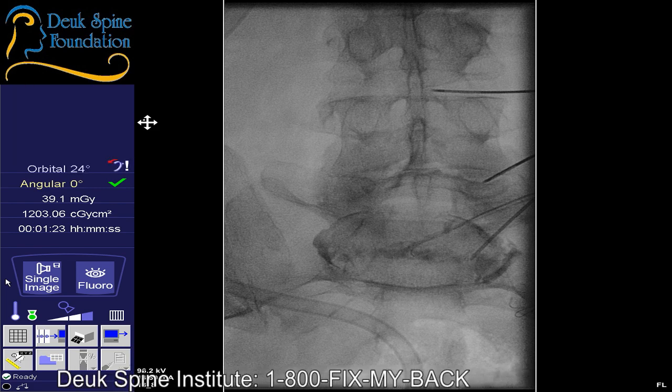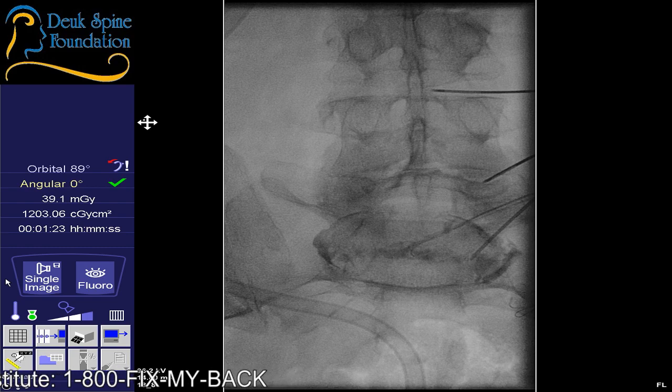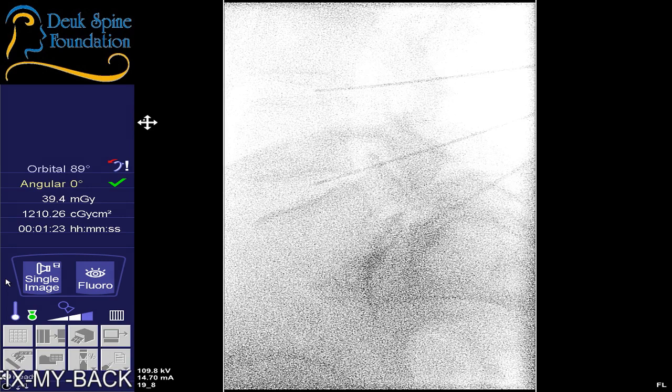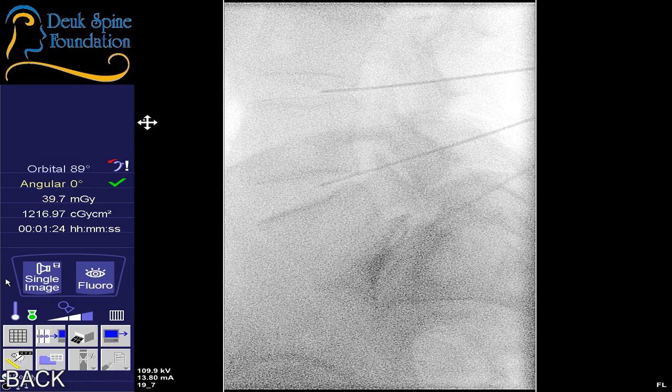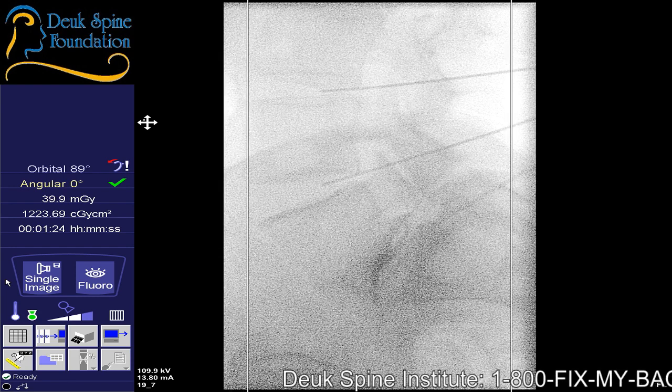Have you felt anything at all? No. Show me. Are you pulsing? I don't want you to pulse. That's non-pulsed? Not much difference. You have the collimators closed down so we can direct the energy where it needs to be and not just everywhere.